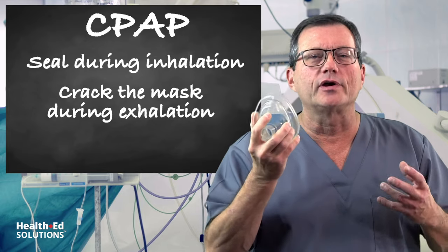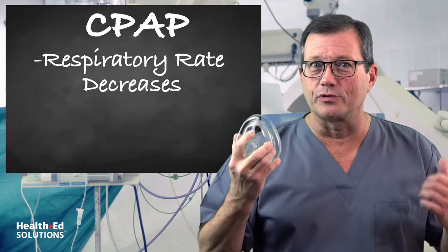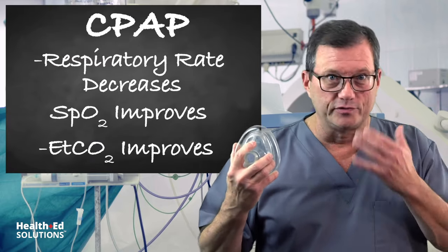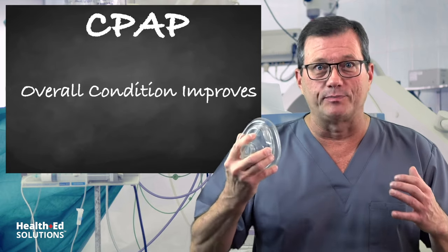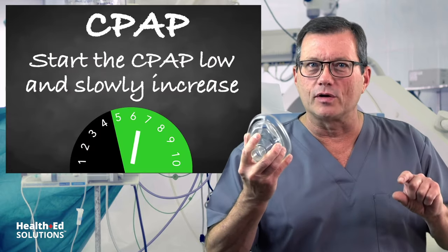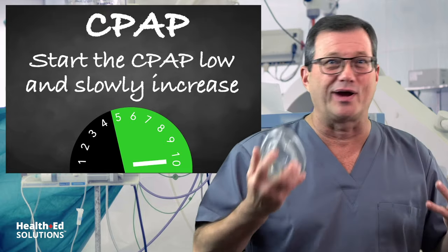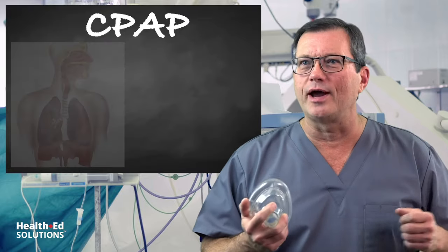How do you know it's working? Their respiratory rate starts to come down, sats improve, and end-tidal improves — which you should have on at the same time. Another technique: always follow your local protocol, but consider starting the CPAP at a lower level and gradually increasing it to gain compliance, rather than strapping it on and watching the patient wrestle with it.